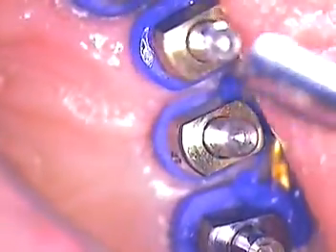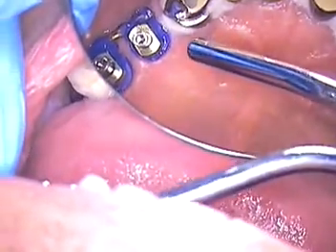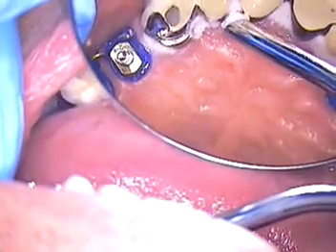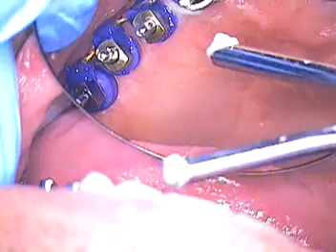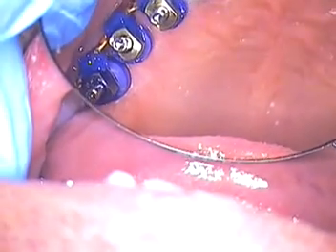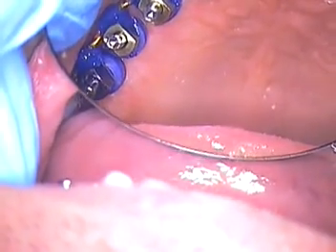Each impression coping had to be customized, and now we're linked and ready to go with the impression. We've also blocked out the anterior region, and I'm going to wipe just a little bit of that off now that it has expanded a little bit. So we'll do that and get ready for the impression. These are joined together in an open tray situation — we'll be trying in the open tray in a few minutes.